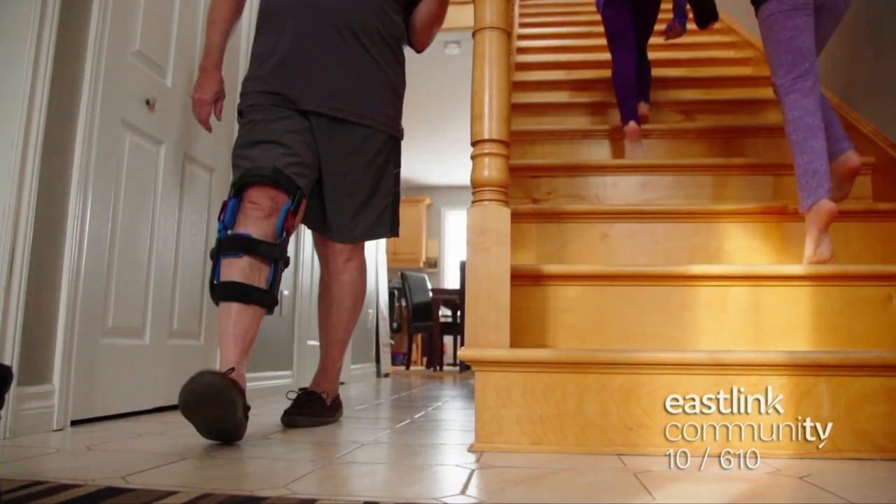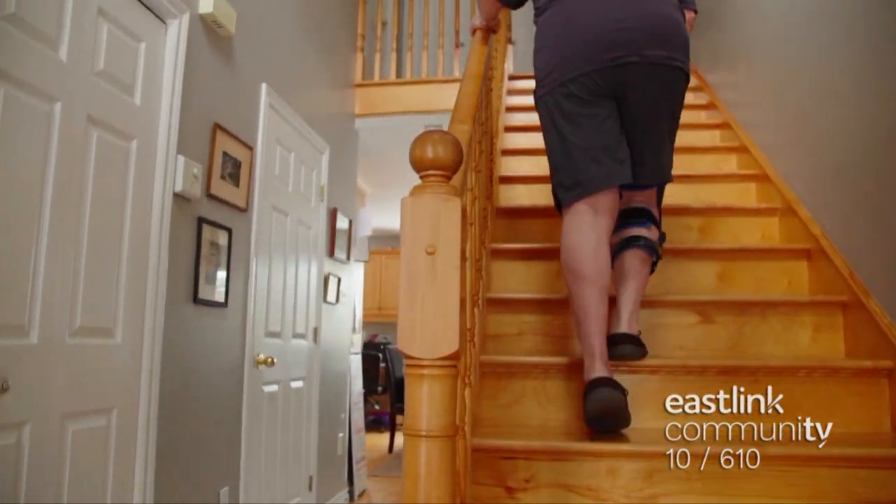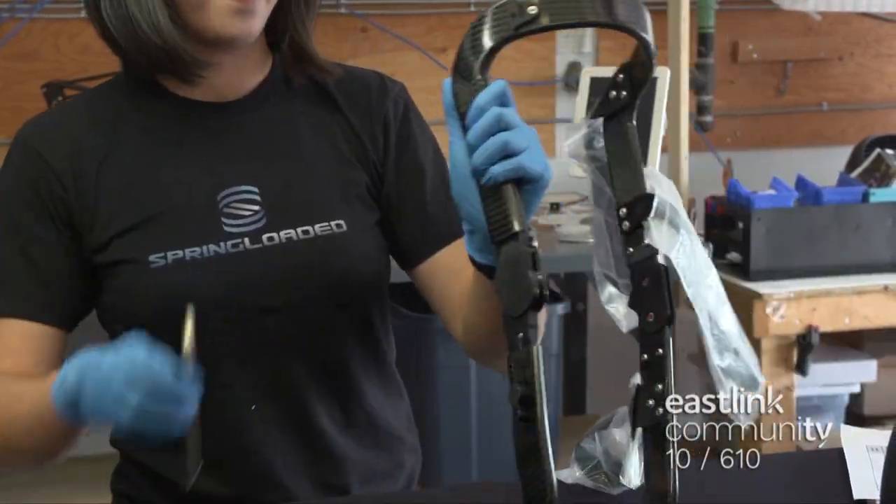These patented springs work by compressing a liquid to store energy as you bend your knee, then returns that energy to the brace to help power and protect you when you extend your leg.